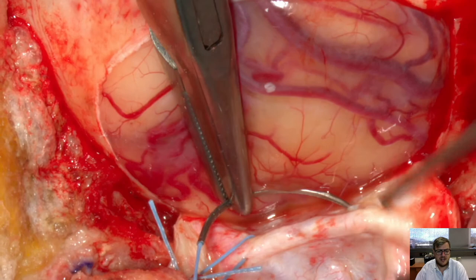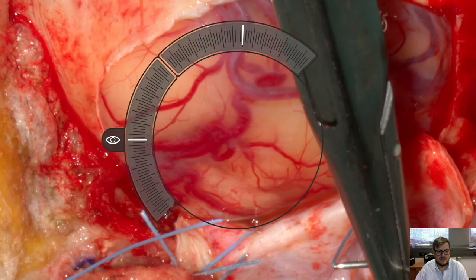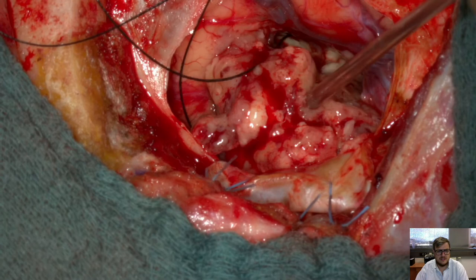This is the first cranial case we did. It's a frontal metastasis. You see the dural opening, and now with the second dural suture you can easily see how the robotic scope is repositioned to fix that suture towards the muscle.